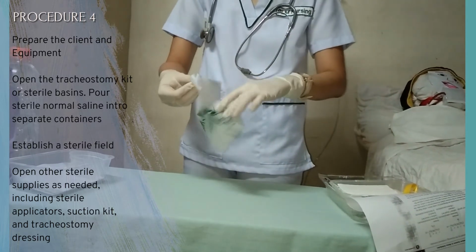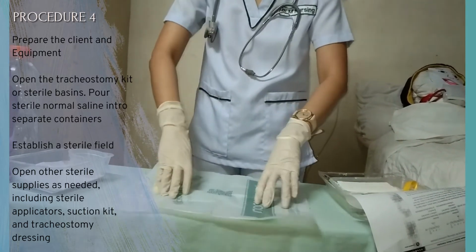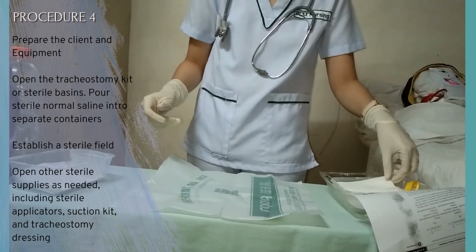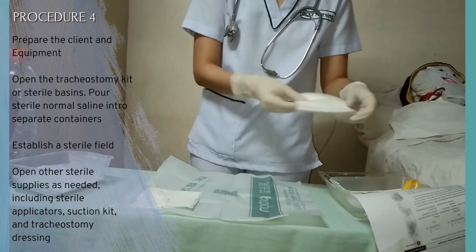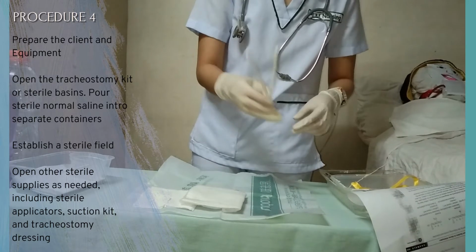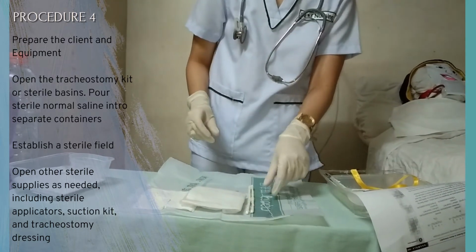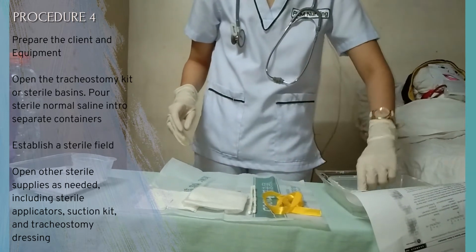Before suctioning, you have to organize the equipment inside the tracheostomy kit, for your hands are still sterile. Inside the tracheostomy kit, we have the tracheostomy dressing, gauze pad 4x4, pipe cleaners, pipe brush, cotton applicators, and twill ties. We also have the containers.